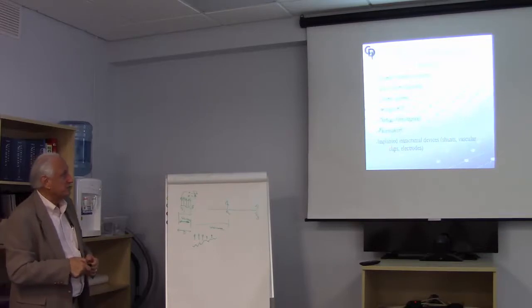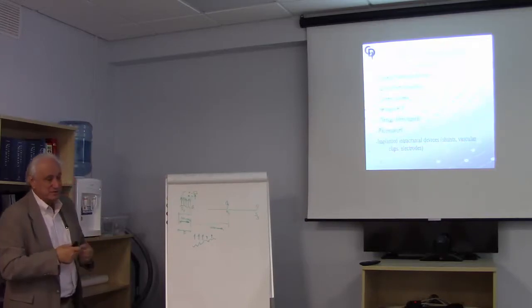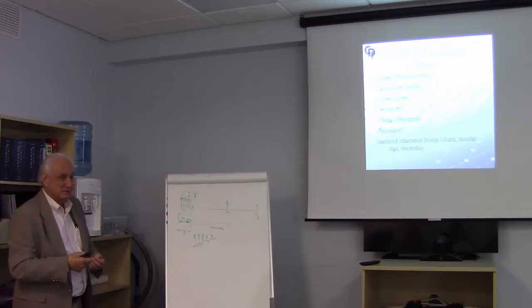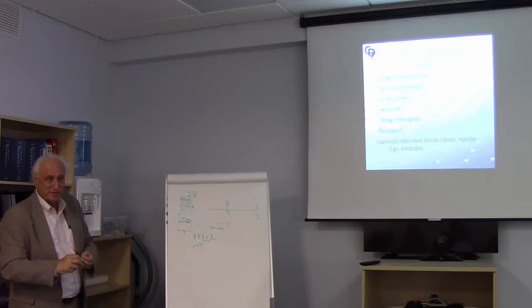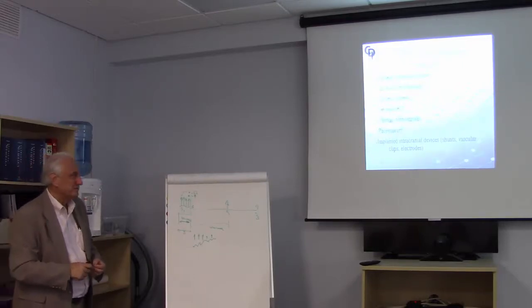The things I worry about the most are these implanted intracranial devices: the shunts, the vascular clips, electrodes. By the time the fields get to the brain tissue, they're not that strong, but it doesn't take a lot to change the orientation of a clip or to make a small change in the direction of an implanted electrode. And sometimes small differences there can make a big difference in terms of results.